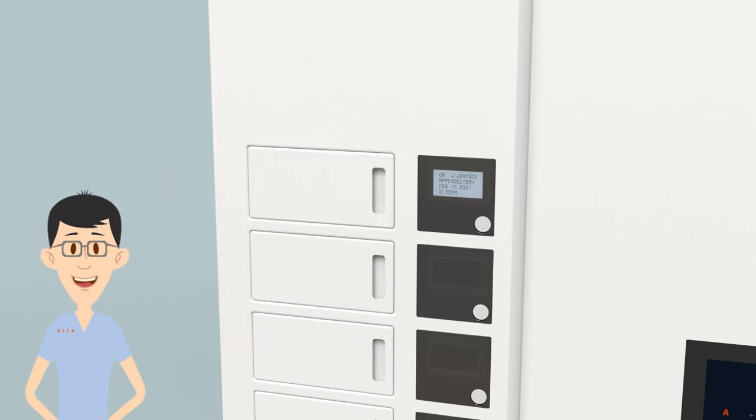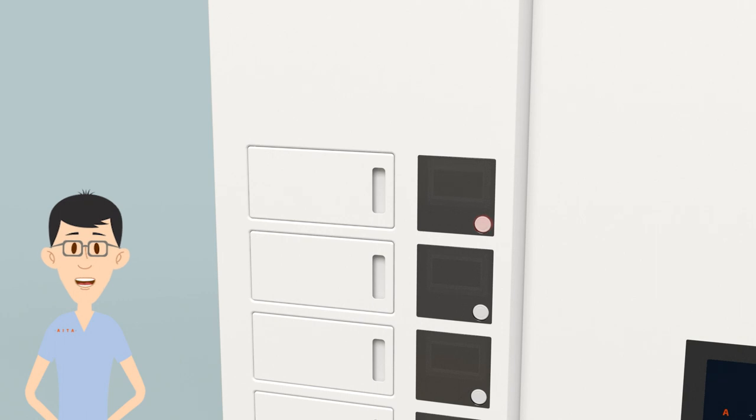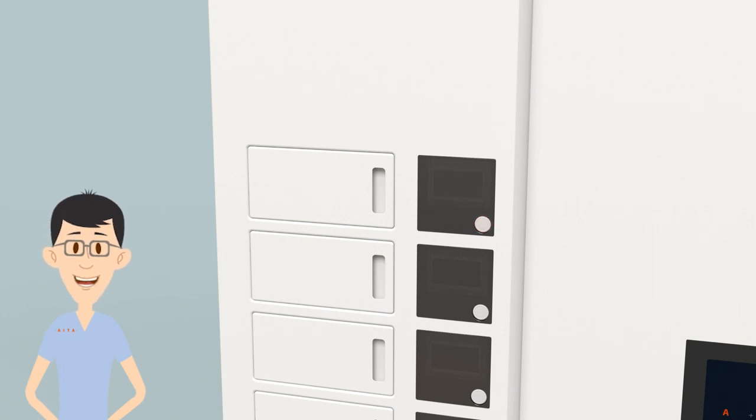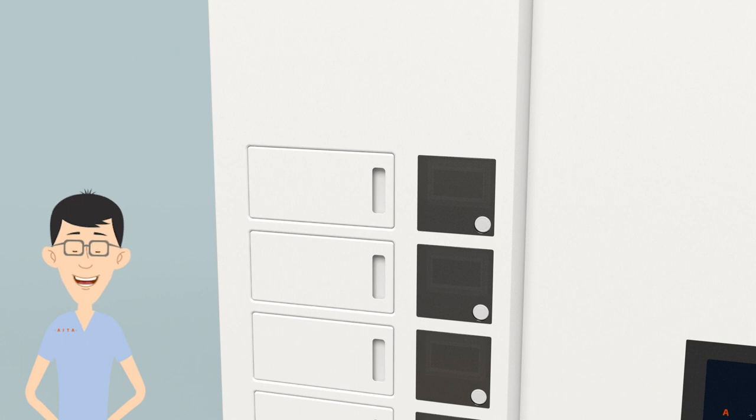Close the locker door and make sure to press the button next to your locker to confirm retrieval. The button must be pressed or else the locker will not be utilized for additional cases.